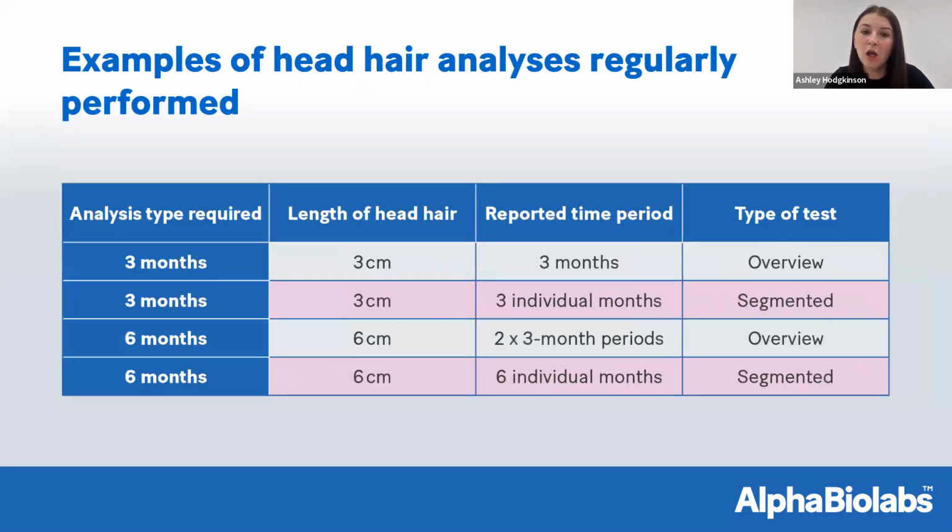So coming to the end of the first part now, in relation to head hair testing, we've spoken about how it gets there, what we need to do the test and how much of a sample would be taken and what the alternatives are. But I thought it was a good time to just recap over what we've discussed, because the biggest thing that we come across here that either delays cases or stops samples being taken is that we have insufficient head hair.